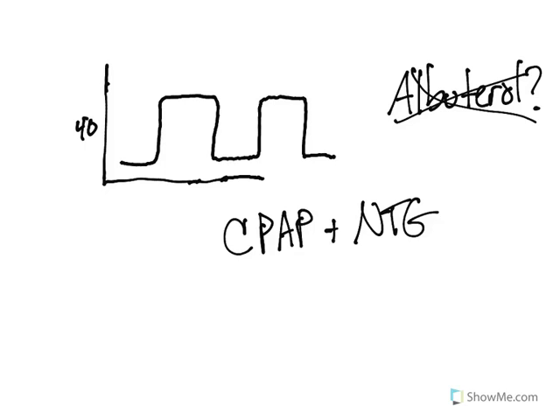They need to be opened up. Now, you'll notice on the end-tidal CO2 that the numbers will generally be pretty normal. They'll be pretty normal, maybe a little high, but they'll be pretty normal. But your SpO2 on the CHF patients, that's going to be pretty low.